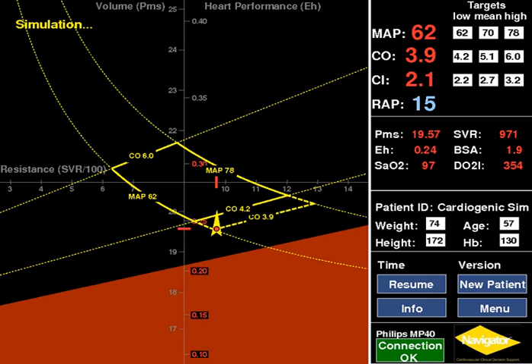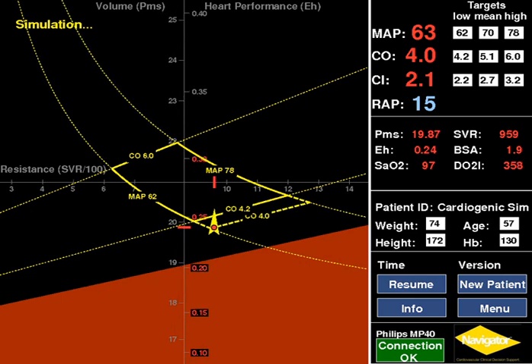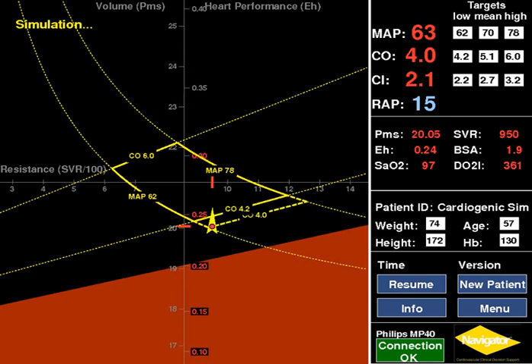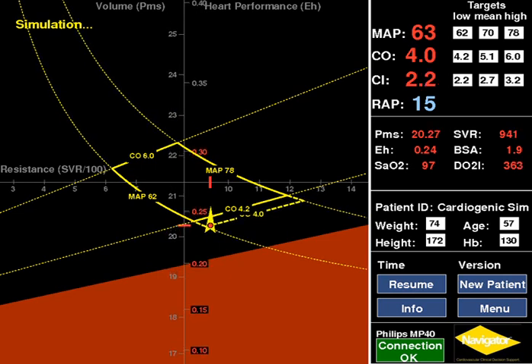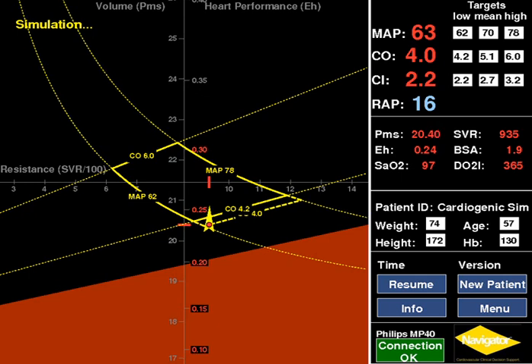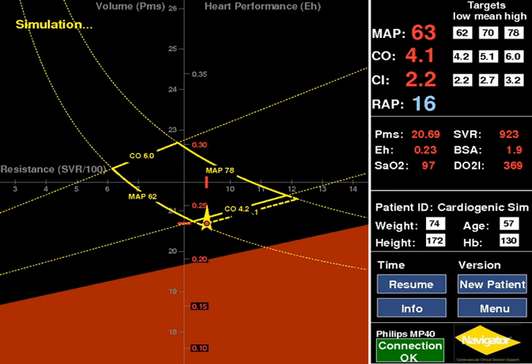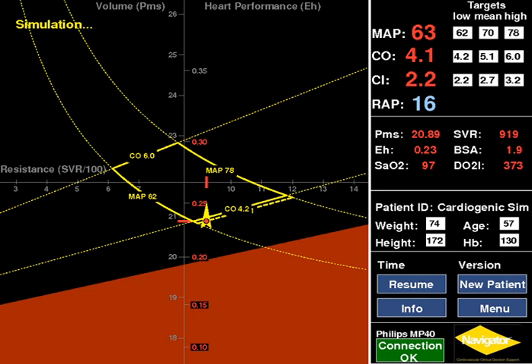These responses to a fluid challenge collectively indicate the patient is no longer volume responsive. The patient demonstrates four observations that suggest low volume responsiveness: a low EH, an EH value that decreases with volume administration, the RAP rose quickly with volume administration, and minimal movement of the patient's status towards the PTZ despite an increase on the volume PMS scale.